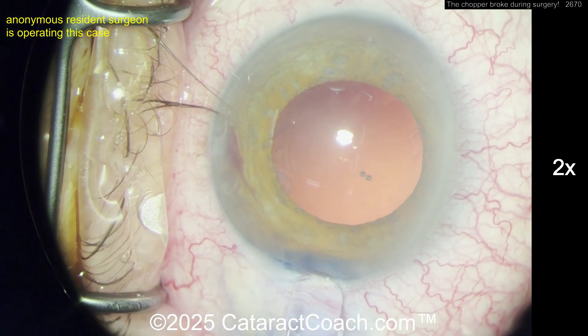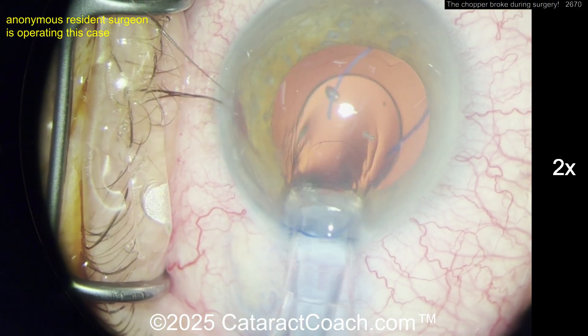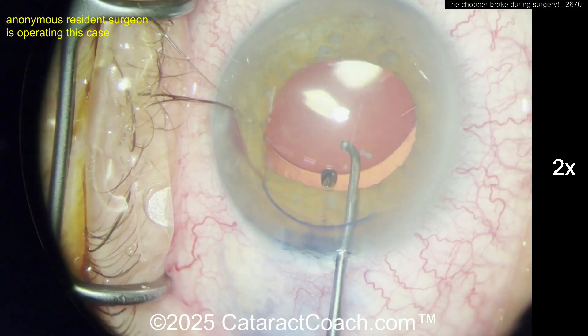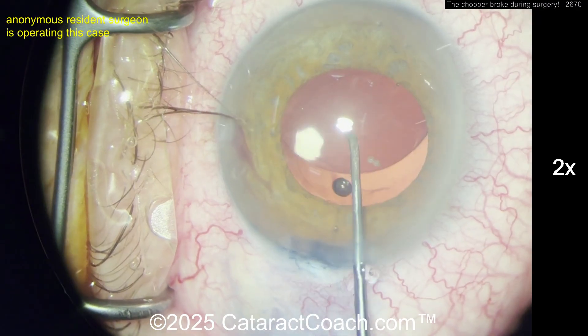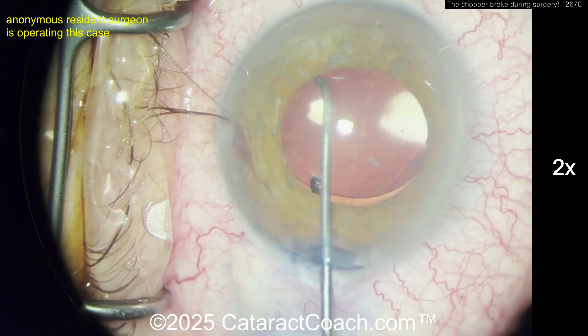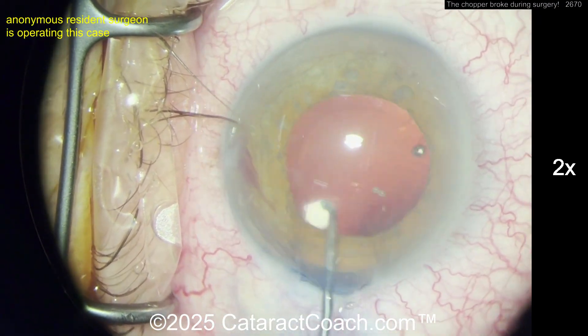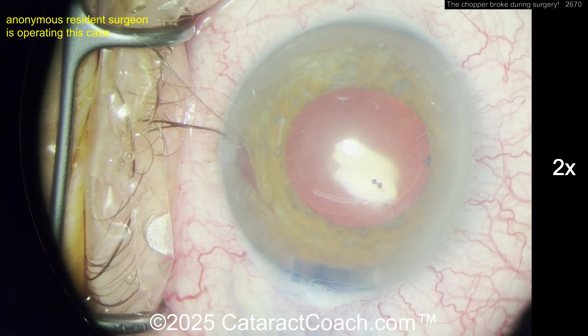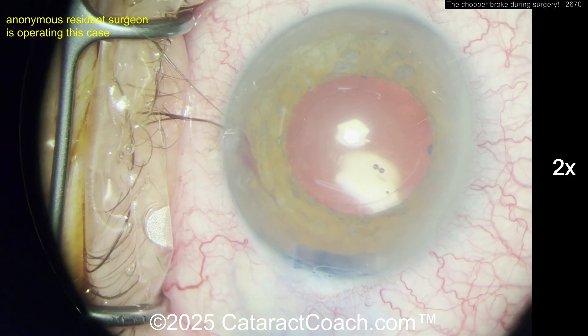Here comes the lens. I want to make sure the capsular bag was filled with viscoelastic. There's a little bit of bleeding — maybe a little bit of iris damage. Here comes the lens going into the bag — looks good. It's a three-piece lens; get that dialed in the bag completely. Not sure if the trailing haptic went in the bag — I'd lift that iris up to make sure it's under the rhexis.